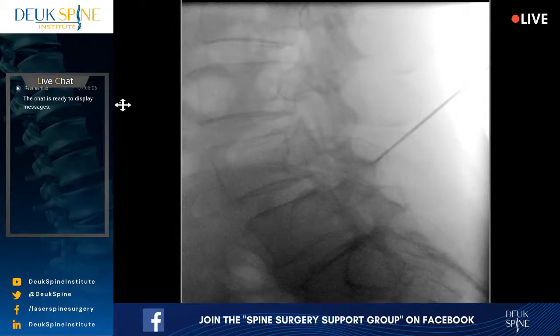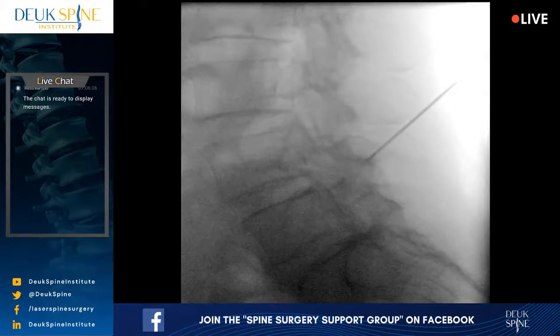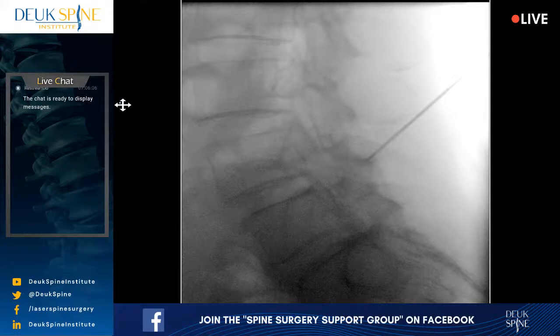Better or worse? That looks better, right? Does it? Am I imagining it? It kind of looks better to me. Let's try that and let's play with the orbit a little bit. Lock the WAG and let's play with the orbit. Just give me a degree one way or the other. Let's see if we can improve it. I think that looks worse, right? Let's try it the other way.